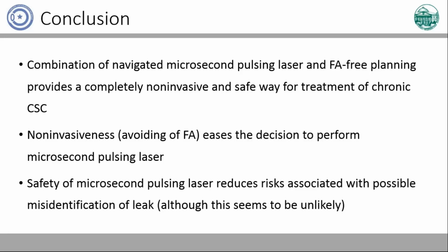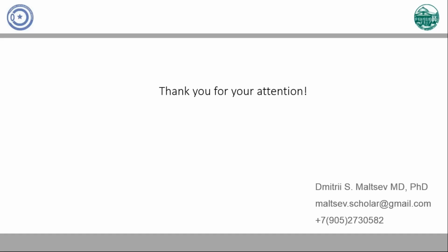a very good and safe option to treat chronic CSR cases because both sides of this approach facilitate each other. Non-invasiveness of this approach, avoiding FA, eases the decision to perform laser specifically for a patient, and vice versa. Safety of micropulse laser reduces the risk associated with possible, I believe highly unlikely, but possible misidentification of the leak. Thank you for your kind attention. If you have any questions, I would be happy to answer.